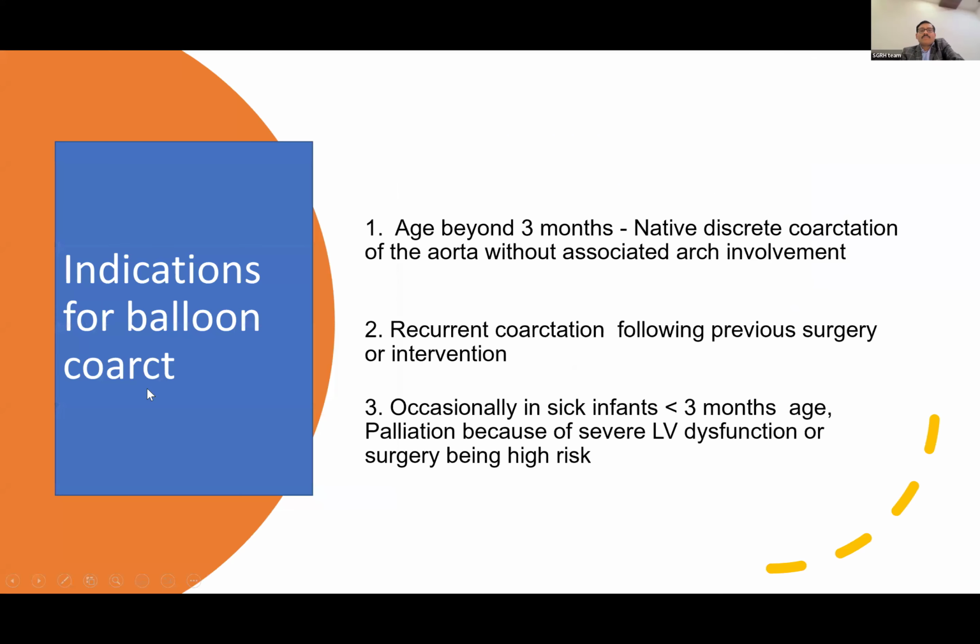Now, the indications for balloon coarct are very simple. I think we all know about these indications. Age beyond 3 months, native discrete coarct of aorta without arch involvement, is an indication for balloon coarct.